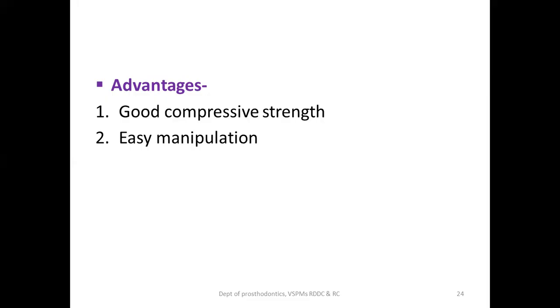a thick, full glass slab, using a larger surface area, and how to add the powder increment-wise into the liquid, with each increment mixed for 15 to 20 seconds like this, and take the material in the required consistency for the purpose for which you are using it. So if you take all the precautions, it is not so difficult.